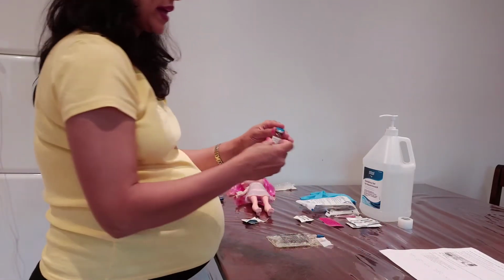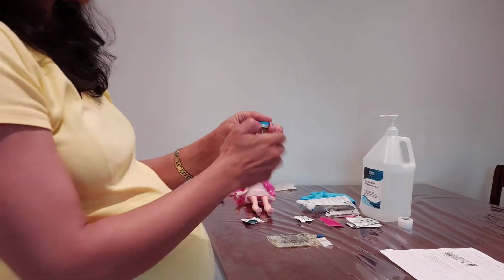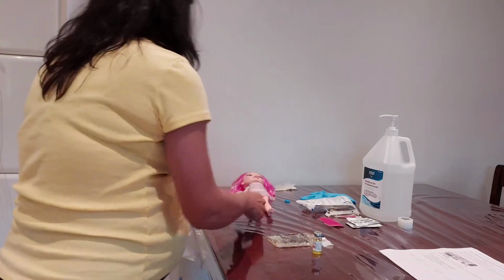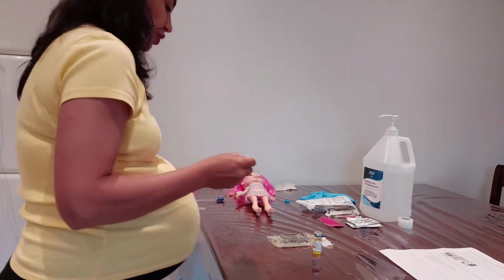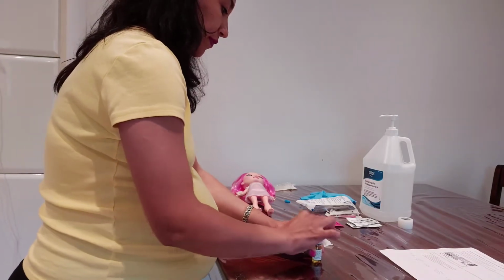Then I will recap the pre-reconstituted medication. I will clean the rubber cap as well. It's clean, but I will clean it as well.